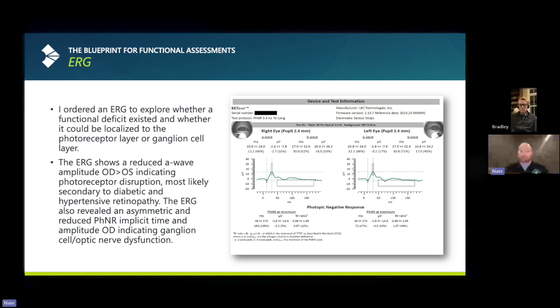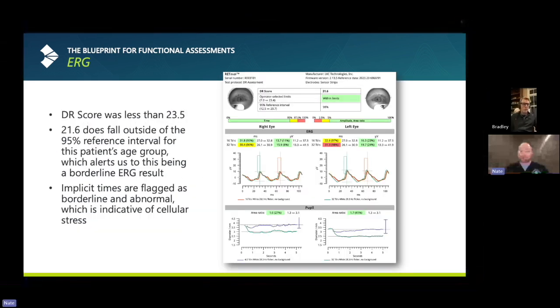It's often asymmetric, and that's why you look at not only this number, which gives you kind of a global picture of where we're at binocular with both eyes together, but I look at the qualitative data here and here, and I dive into these numbers as well. So these are really where you parse out that asymmetry. What is the exact speed in the right eye, and the strength in the right eye, and the speed in the left eye, and the strength in the left eye, looking at the qualitative data in both. You're looking at the pupil response. And again, it summates all of that to give you one number that represents the patient overall. But if they have asymmetric disease, you dive down into the numbers, and that's what I'm going to follow over time.